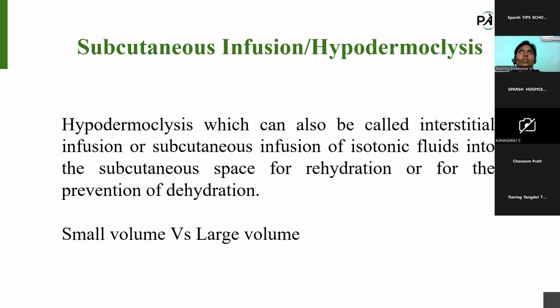If the patient is mildly to moderately dehydrated, we can choose this subcutaneous infusion. The main thing is we can only introduce a small volume.